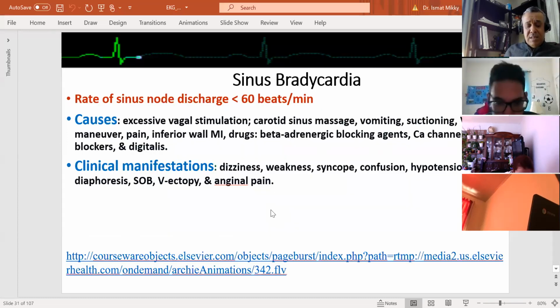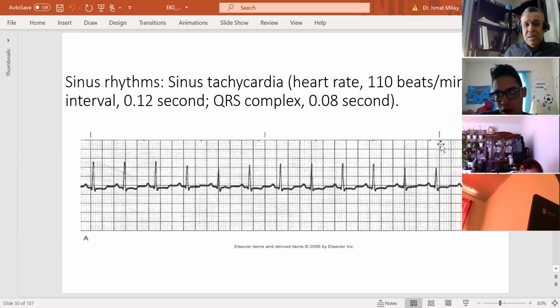Professor, I just wanted to know, how do you know when to take that other wave? Because there was one EKG before this where you took one more. Yeah, there's only one small box right here. The other one was about 3 small boxes. And this one is within. If you want to count this, it's going to be way further, right?